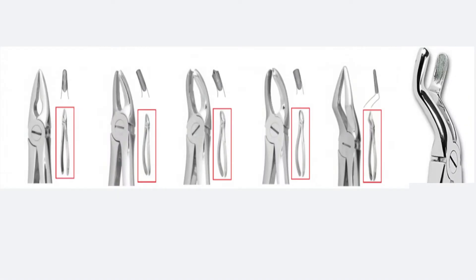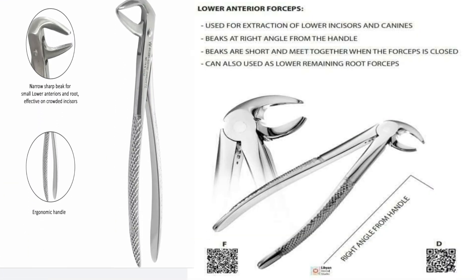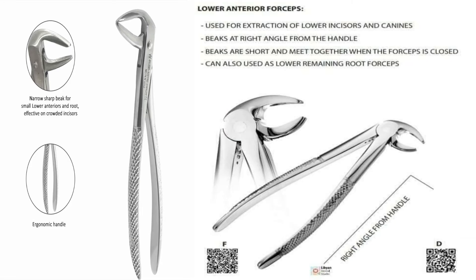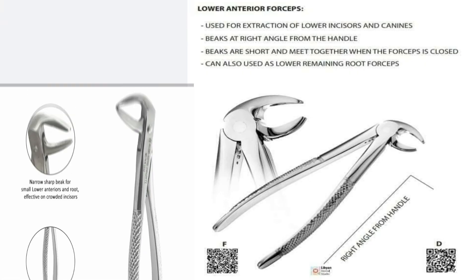Those were the forceps used for upper teeth extraction. Lower anterior forceps have fine blades. The blades are perpendicular to the long axis of the handle with no space between the blades. They are used for extraction of the lower central and lateral incisors — both right and left — with the same forceps. For lower canines, a larger-sized lower anterior forceps can be used, or the same size.